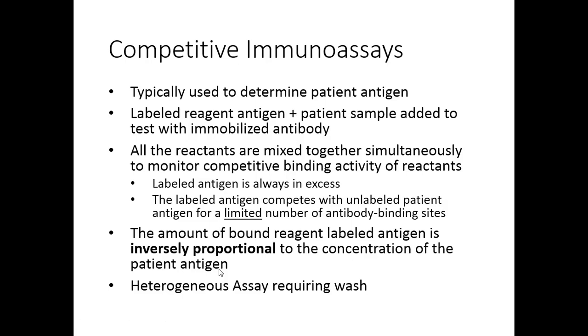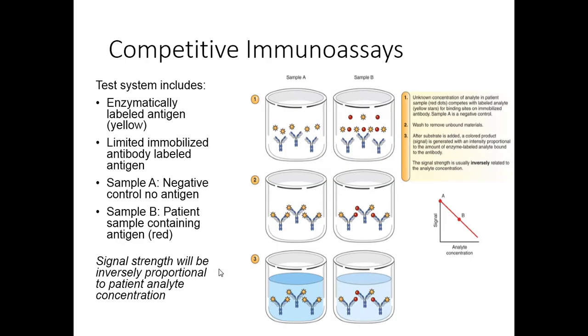And competitive, what do we know? It's heterogeneous, so it requires what? It requires a wash, right? Let's look at this test system from page 157 of your book. A couple of notes before we get started. Number one, remember, competitive immunoassays are always heterogeneous, so they require a wash. Anytime you get antigen-antibody binding, you're going to wash afterwards, right? You're going to wash away the excess.